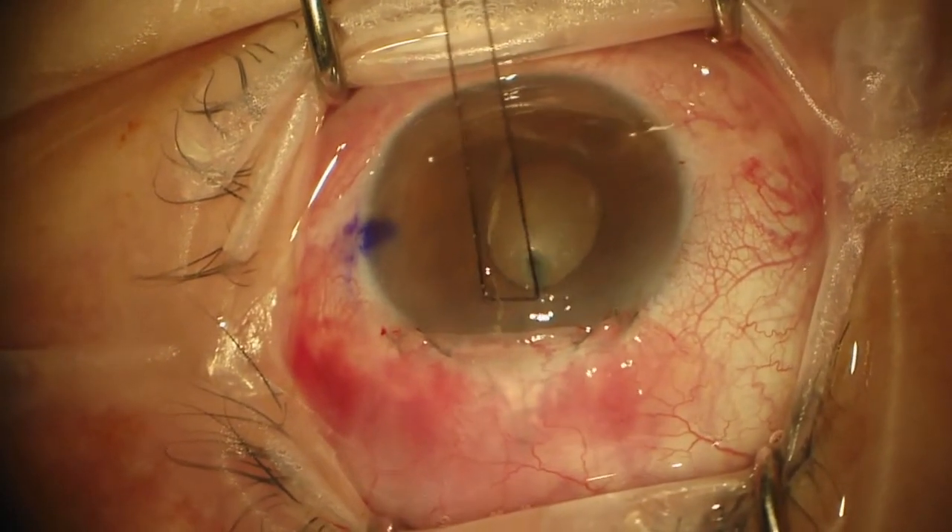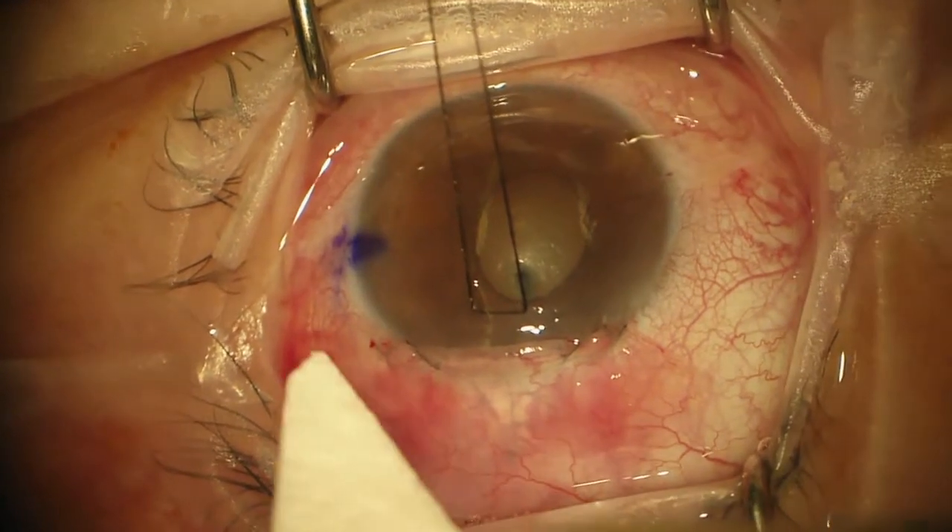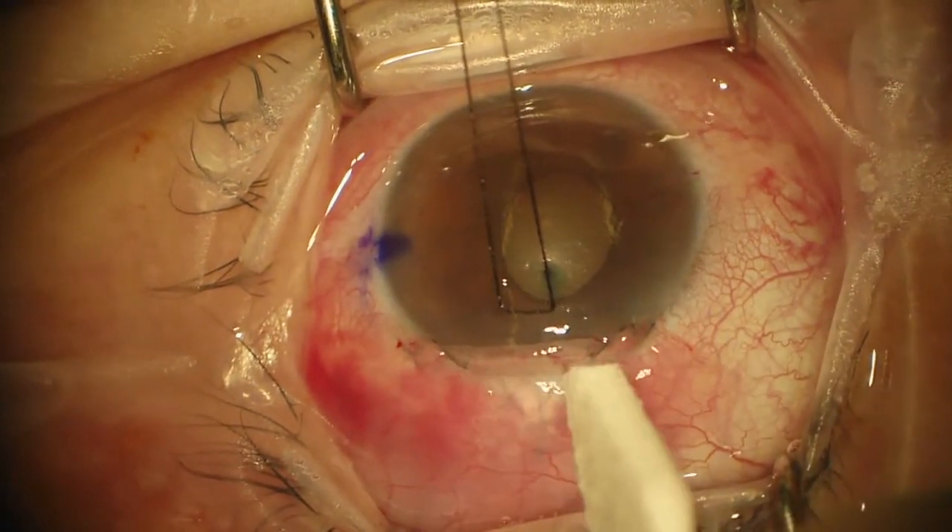Now you can see the bleb is elevated all in here and nice and taut along the limbus.